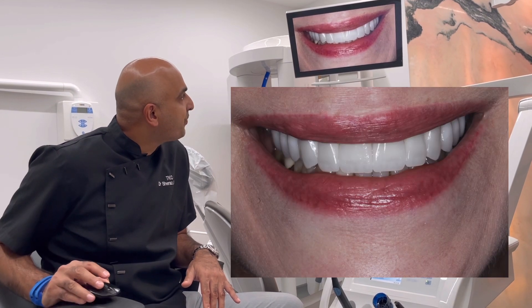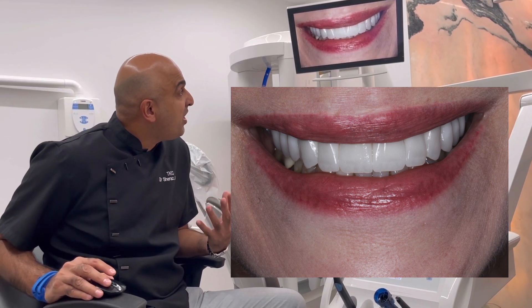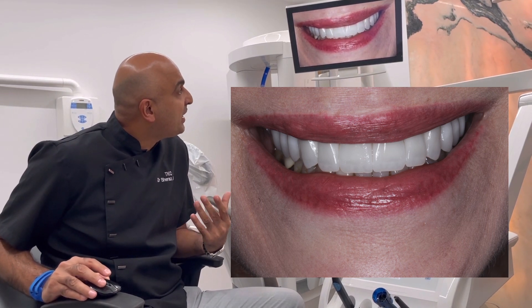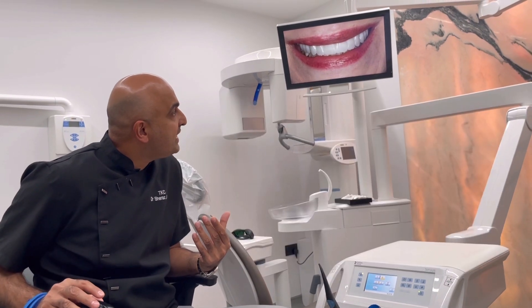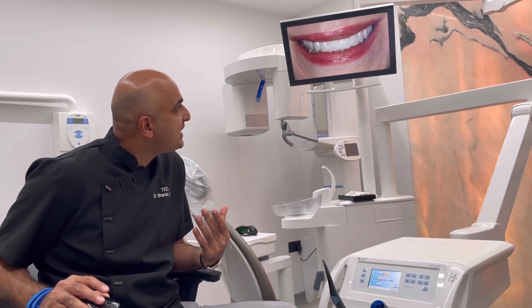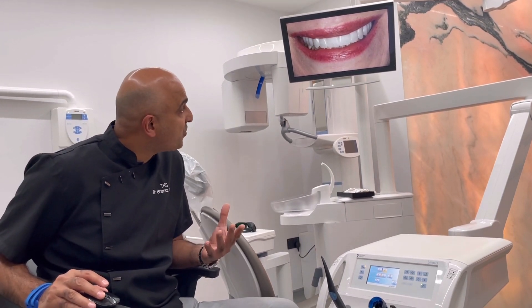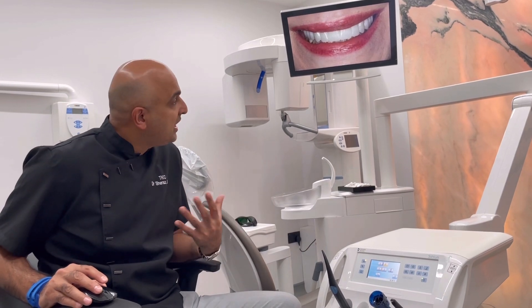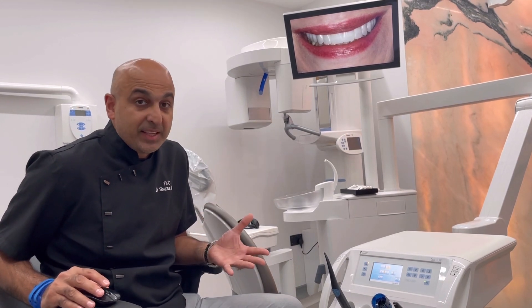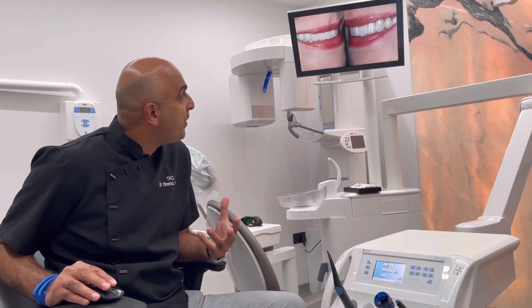This is the end result, and I'm very proud of this case because it came out so nicely — but it was very challenging because these teeth are very long and the patient insisted on keeping that length. Ideally I'd like them to finish a bit shorter, because that's what I want to see in a smile. But since the patient insisted on that design and that length, we managed to put in lots of translucency and texture so it doesn't look that long now. The porcelain looks really nice — she's ecstatic. Compared to what she had before, it's game-changing.